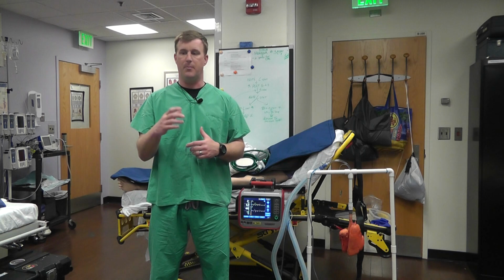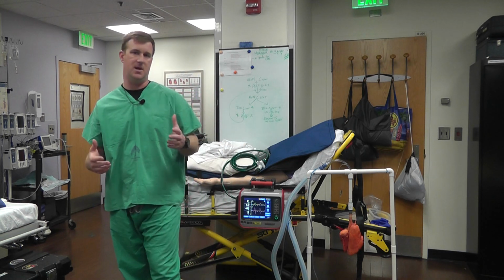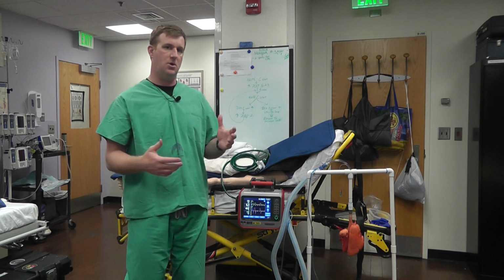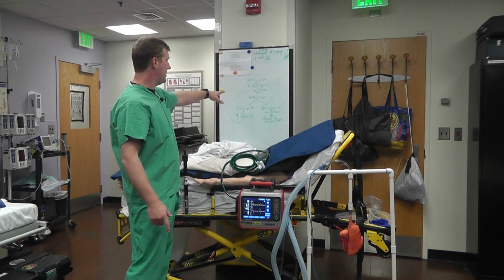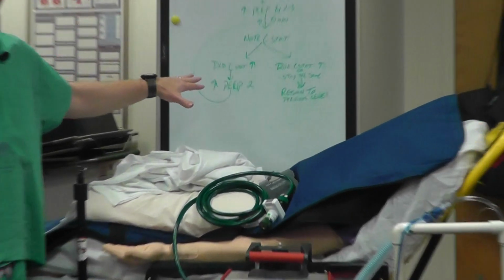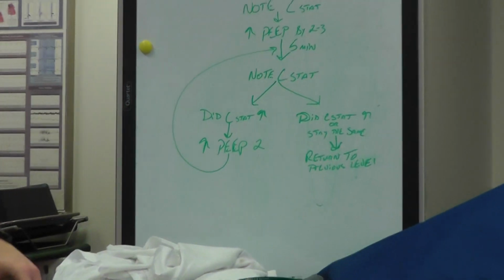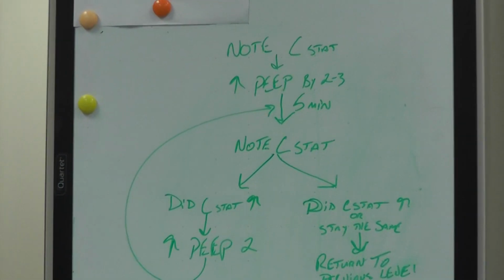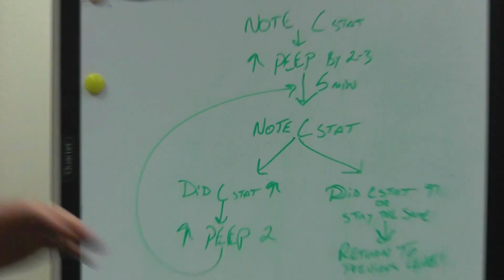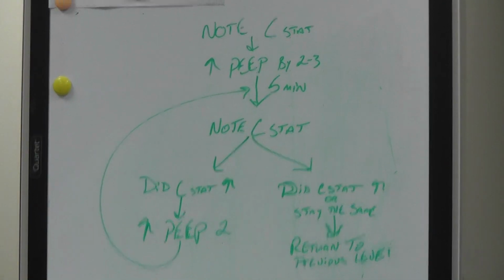It's in the pearls that we put out, it's in our protocol, but it's what's called a PEEP compliance study. Ben, if you'll zoom in up here, I went ahead and wrote it out. This is my chicken scratch handwriting. If you want a better typed out version, it's in the pearls and in our protocols.